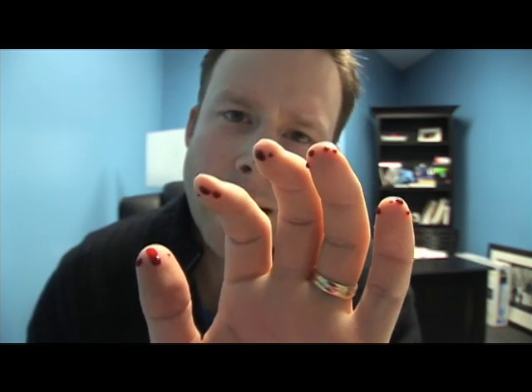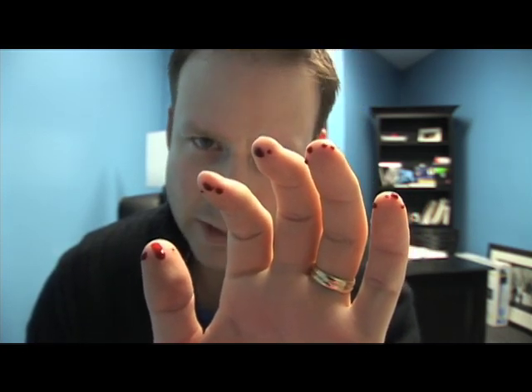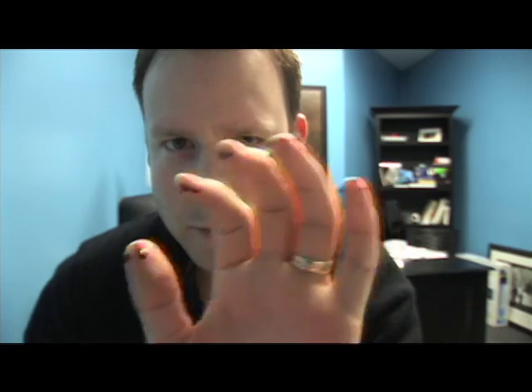Just for the heck of it today I figured I would show you what 16 different finger pricks looks like on one hand. This is basically what happens to me every single day — 16 times a day, 16 finger pricks. But remember, today is middle finger day.